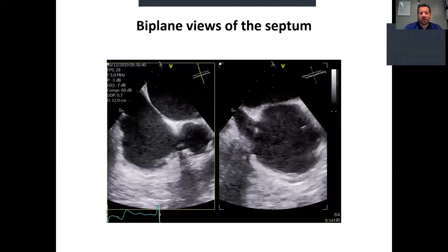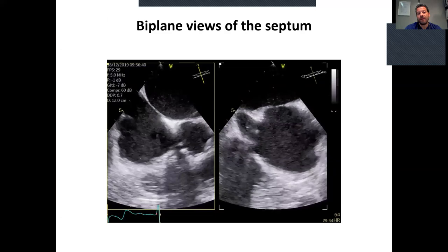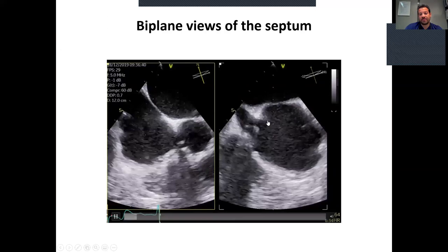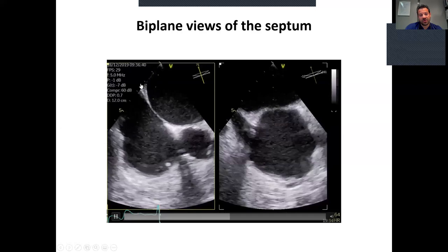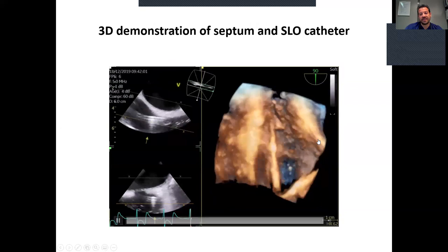When we have the correct diagnosis of the mitral regurgitation, we proceed with the procedure. First, we have to perform a correct transseptal puncture, because if the puncture is correct, the whole operation will be much easier. We have to use biplane views of the short axis and check the superior and inferior part of the septum from the vena caval view. 3D imaging can facilitate the operation.